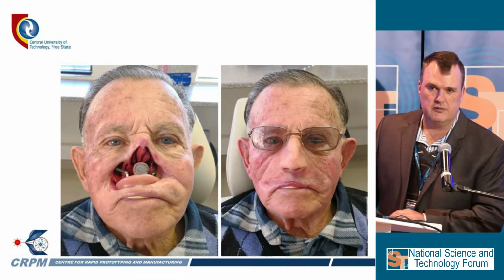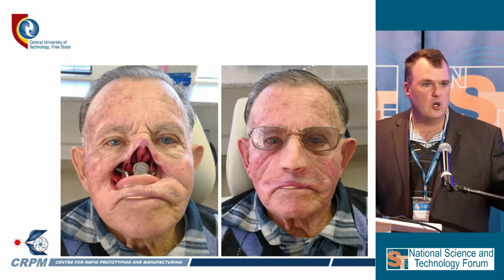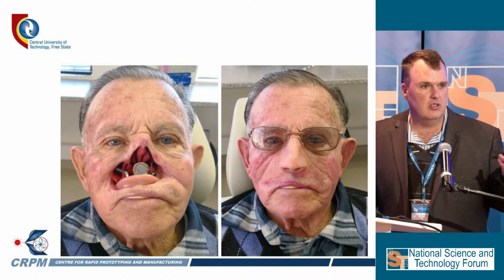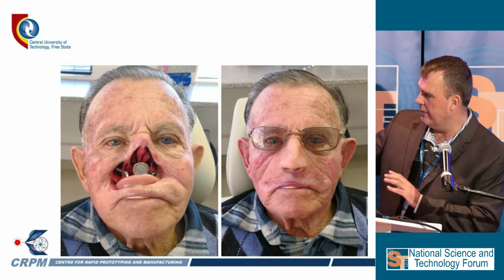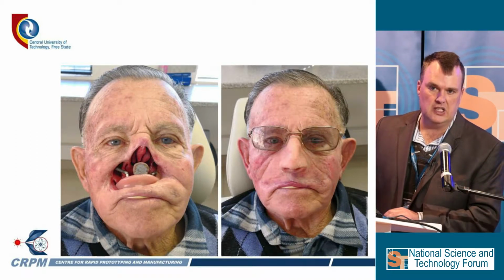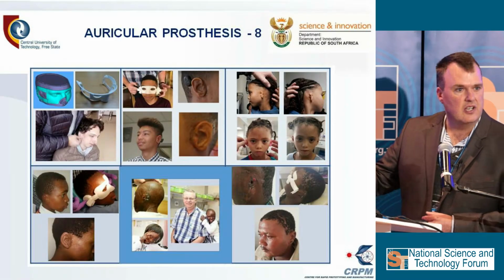So this is a bit tough to see, but if they remove your top jaw, you can't swallow, you can't speak, you can't eat, and this is where we try. It's not perfect, but at least it can go out. Let me just move on. At least it can go out.